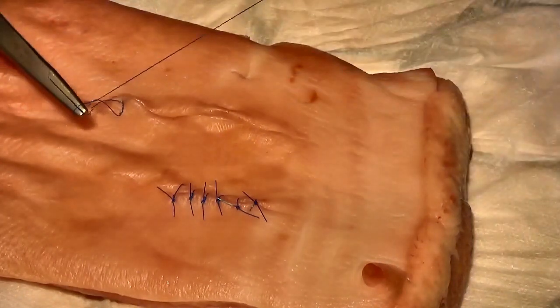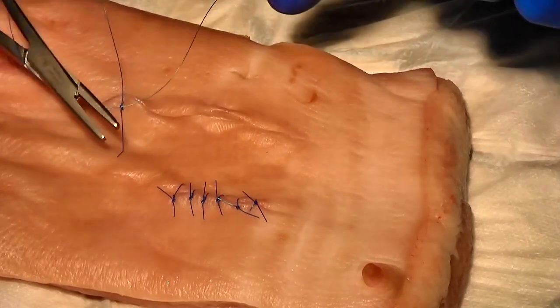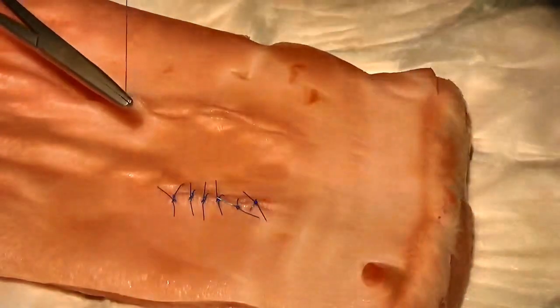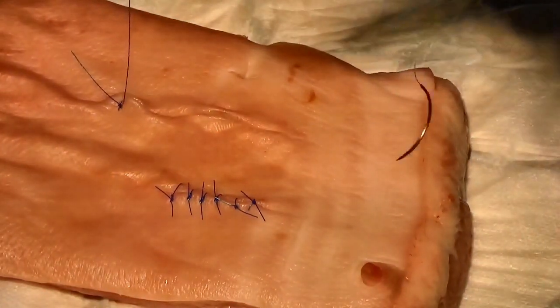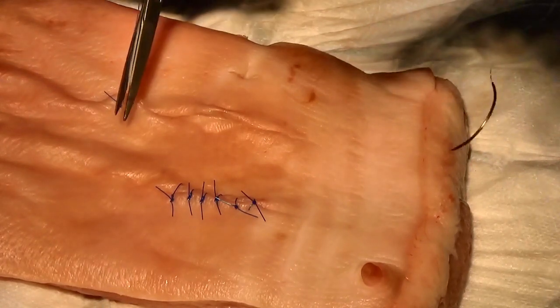You don't have to close all of a wound with mattress sutures. You can do a mixture of mattress sutures and simple sutures. The main aim of the mattress is to bring the tissues together with an everted skin edge.